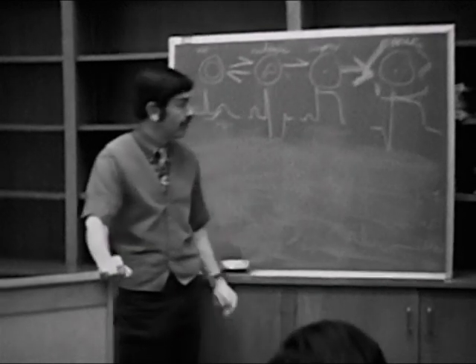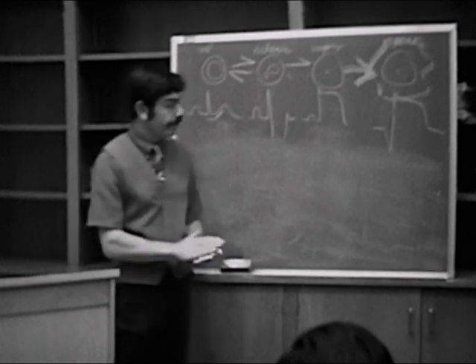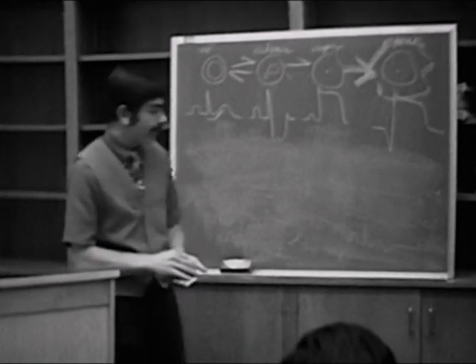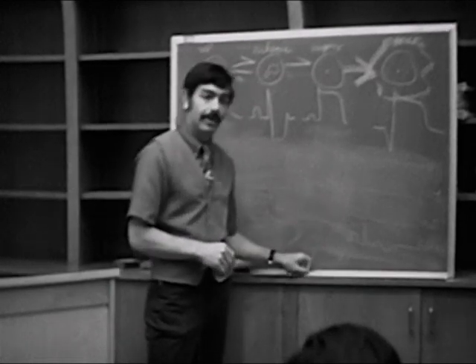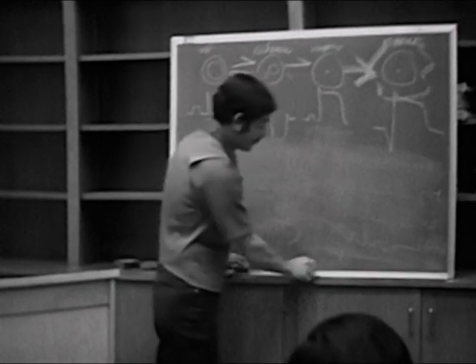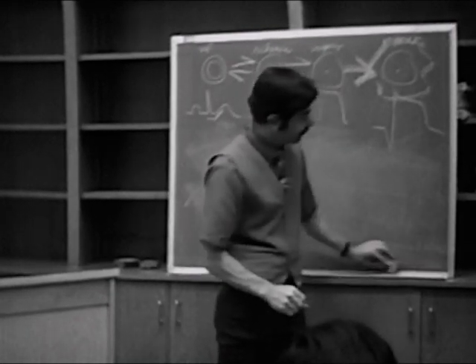So there are quite a few causes of ST segment elevation. But remember also that it can be normal, frequently normal to see ST segments elevated. Not frequently, but not uncommonly. All right. Any questions now about ST segment elevation?